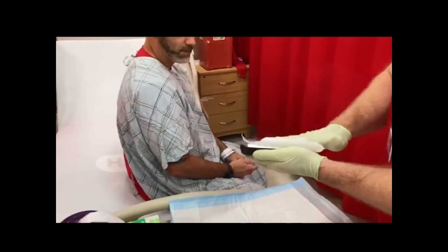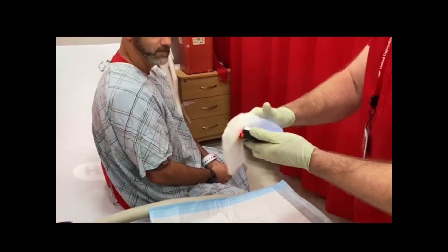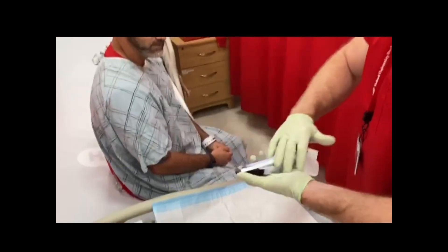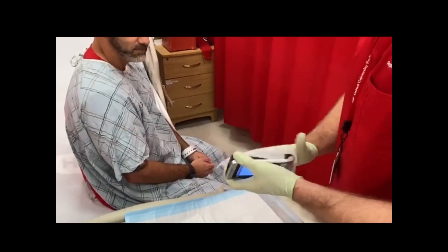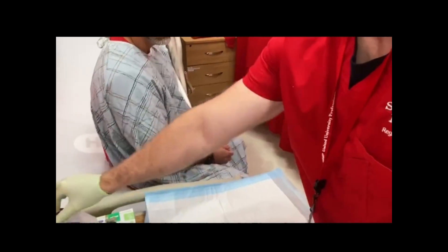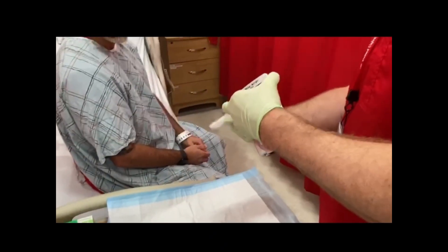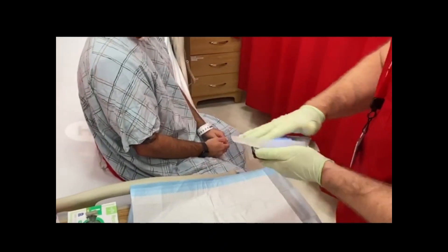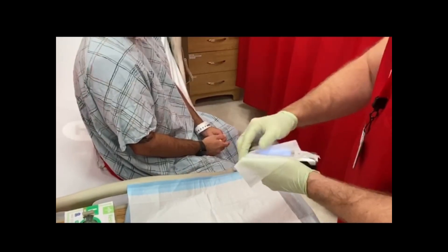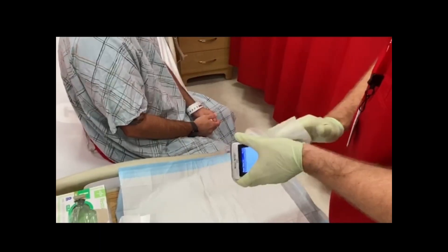Remove a hospital-approved disinfectant wipe from the container. Wipe the external surface of the meter thoroughly with a fresh germicidal disinfectant wipe. Discard the used wipe onto your dirty field. Use a new, fresh germicidal wipe. Thoroughly wipe the surface of the meter — top, bottom, left, and right — for a minimum of three times horizontally and three times vertically. Avoid the barcode scanner and electrical connector.